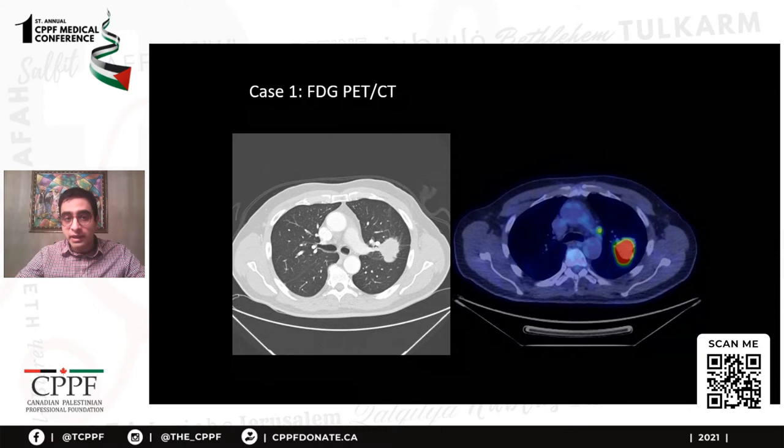What PET does for us is we inject a radioisotope, radio-labeled glucose, that's the FDG part, and look for radioactivity in anatomical locations in the patient. Tumors are typically hypermetabolic, so they're going to uptake glucose, including radioactive glucose, at much higher rate than the surrounding tissues. And that's exactly what we see here. So you see this overlay in red corresponding to a high concentration of the radioactive glucose. So we can tell that this tissue is actually highly metabolizing, raising suspicion for a tumor. So that's PET.